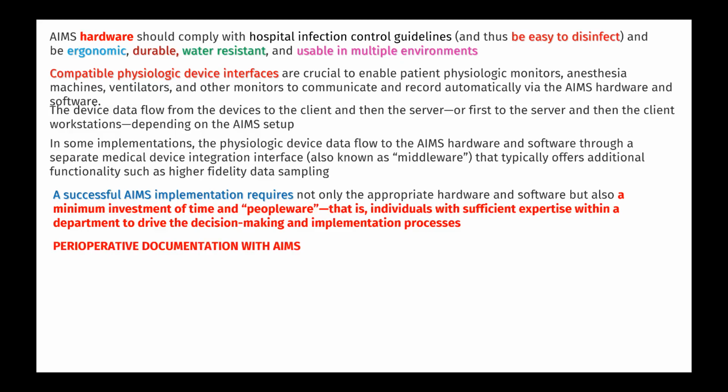So you have to be doubly careful to keep the patient vitals very stable during the management, so that whatever mistakes or unexpected turns have happened will all be documented. Whereas if you are doing it manually, you can skip one or two documentations of the low BP and show the patient as being very stable throughout the procedure.